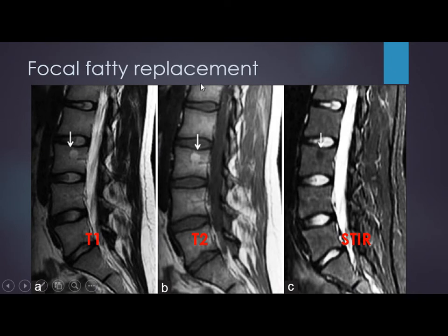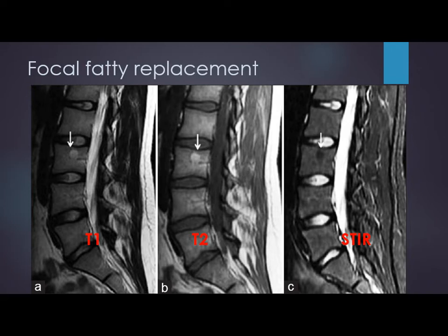Sometimes there is just focal fatty replacement — appearing as a mass that is high on T1 and high on T2. Without other sequences, we might call this hemangioma, although both are benign. On STIR, however, there is marked decrease in signal of the focal fatty replacement, while a true hemangioma will not suppress as markedly because it is not all fat. This helps differentiate focal fatty replacement from hemangioma. If you see a lesion that is not completely suppressed on fat-saturation T2, it is the typical pattern of hemangioma.